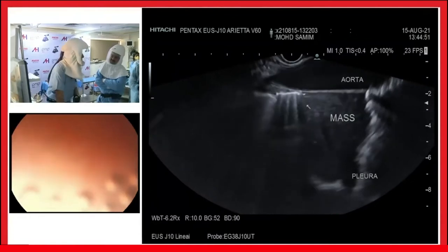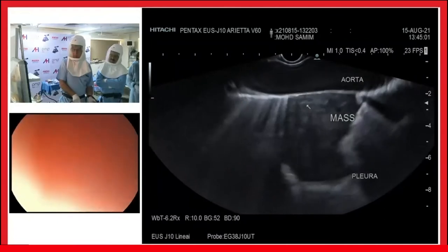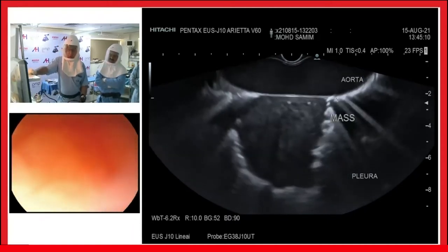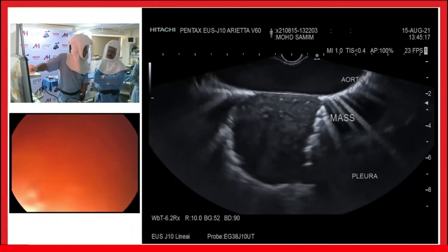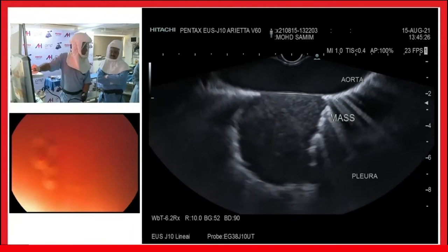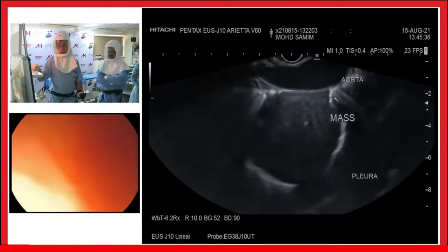And this mass is within the apicoposterior segment of the left lobe of the lung. So I identified there is a mass along the apicoposterior segment of the lung. This mass is not going all the way to the top of the arch of aorta. So is it the apicoposterior segment of the left lower lobe or upper lobe, because the arch is squared? So this mass is of the upper lobe, not of the lower lobe. Upper lobe, which segment? So it is the posterior segment of the upper lobe. So we identified the mass in the posterior segment of the upper lobe.